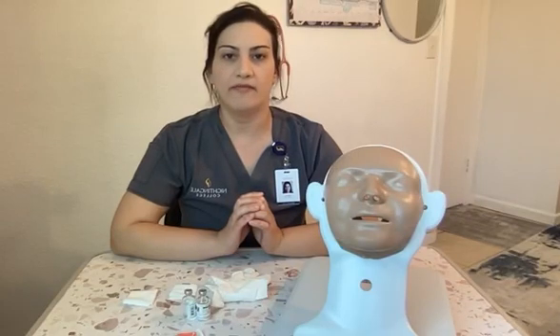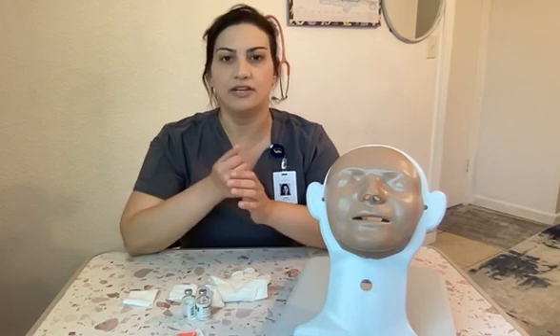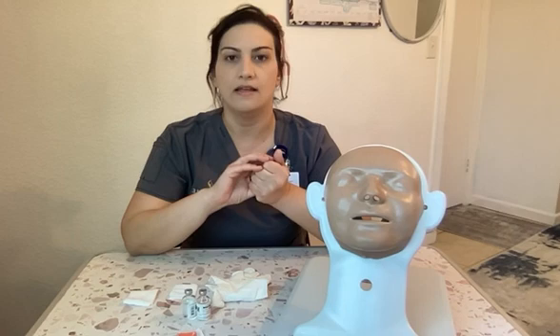My name is Olga. I'm going to be performing the skills video of drawing up insulin. I want to start off this video verifying my physician's order and going over the 6 rights of medication. Right patient, right medication, right dose, right route, right time, and right documentation.